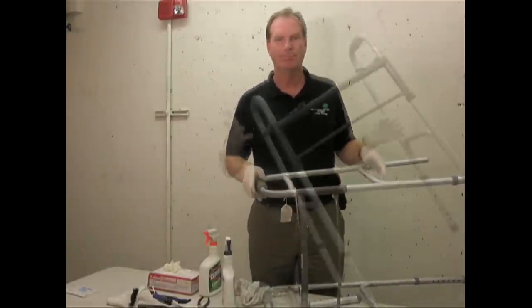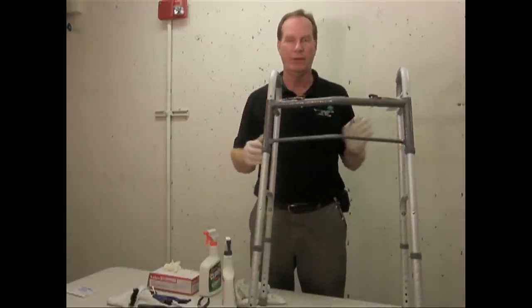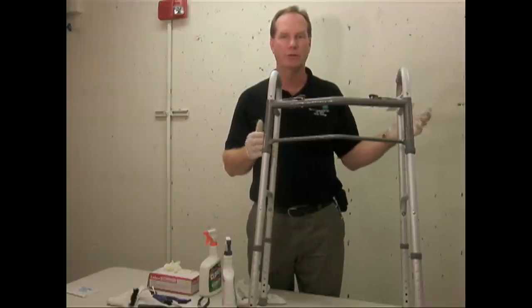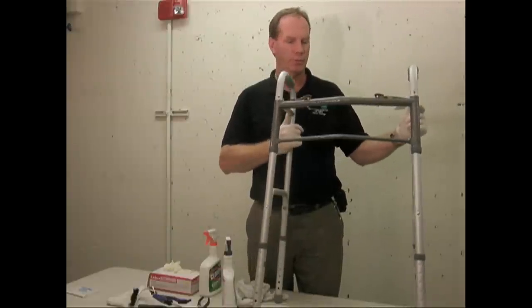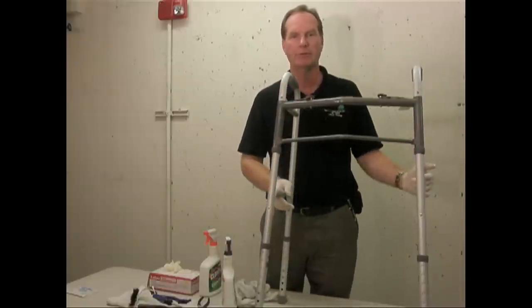Now that the walker is all reassembled and perfectly clean, you want to make sure you keep it in an area that's separate from any other dirty objects so there's no cross contamination. The best way is to cover it with a plastic bag — put it right over the top to keep the dust off and keep the germs off.